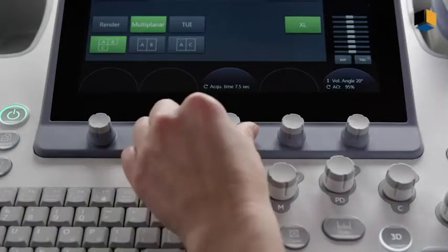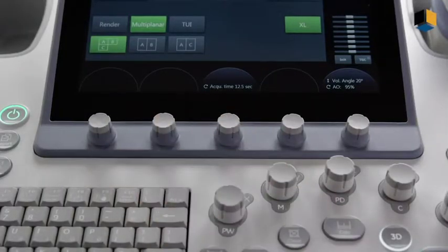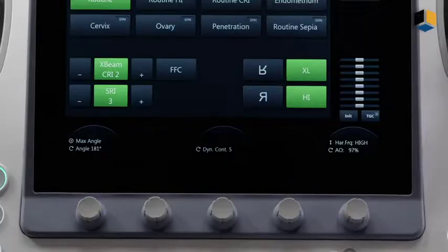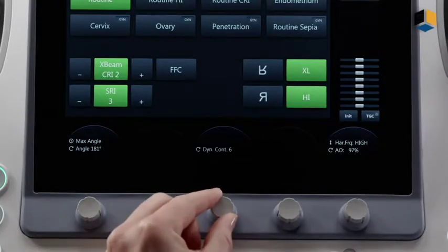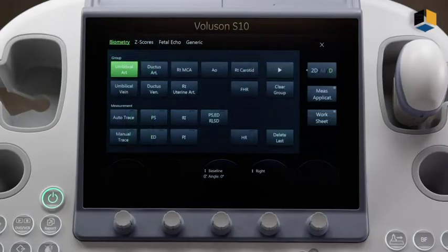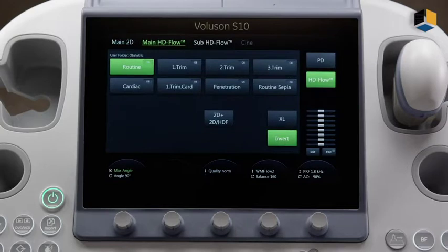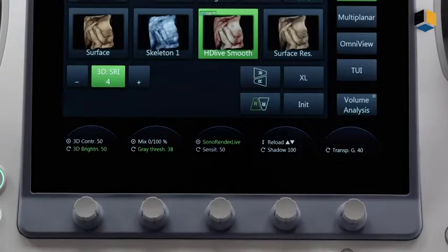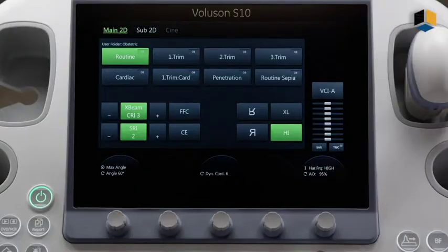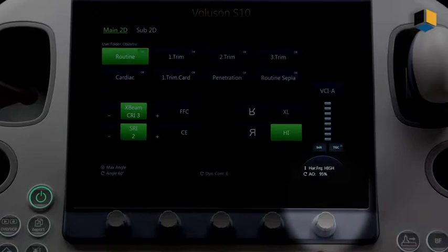Items at the bottom of the touch panel are operated via the knobs below, with a turn or up and down action. The icons on the touch panel indicate whether a function's a turn or up and down. This menu is dynamic based upon which scan mode is selected. When more than one function is available, the active mode is green. Push on the knob for the alternate control. The acoustic output and frequency share the same control knob.